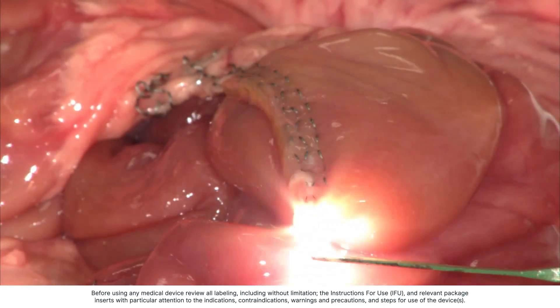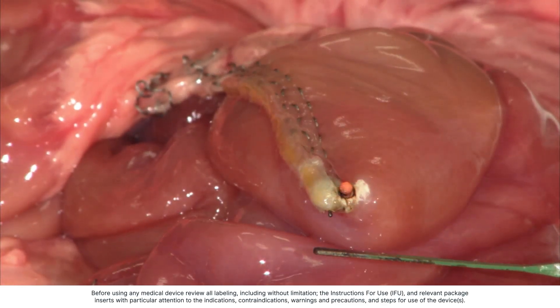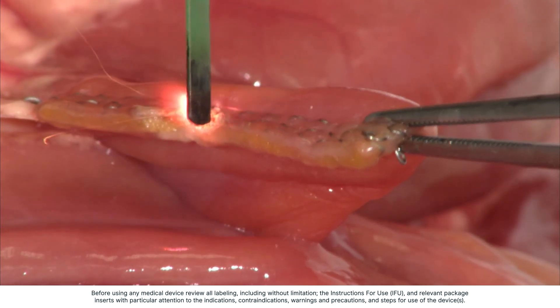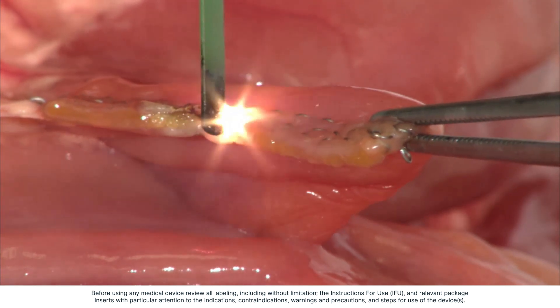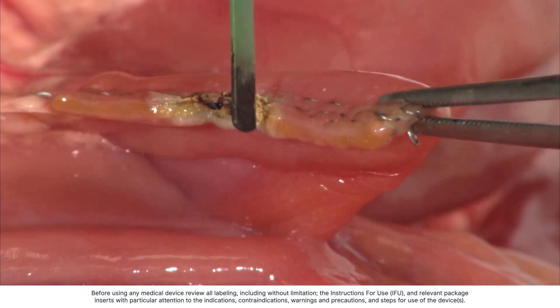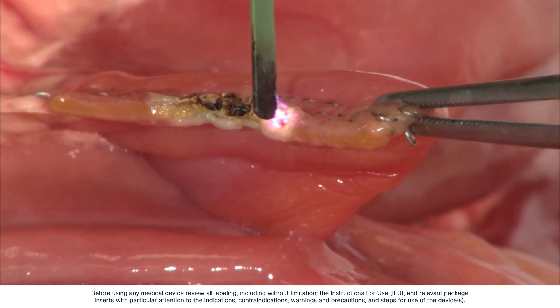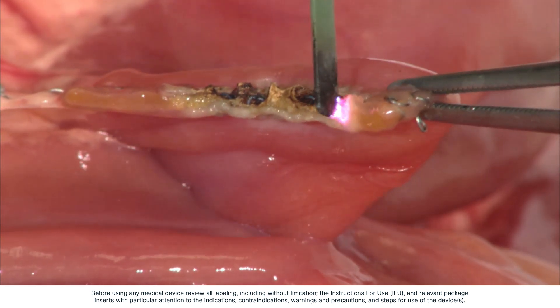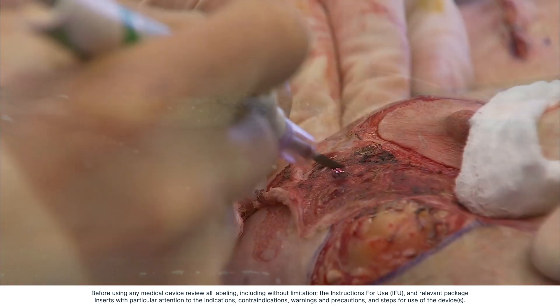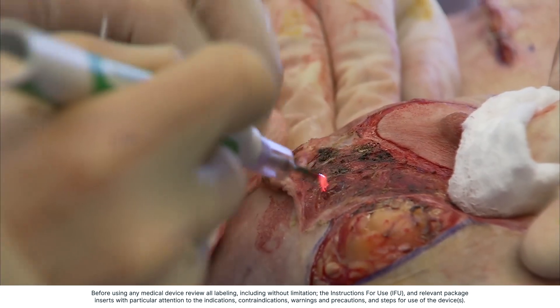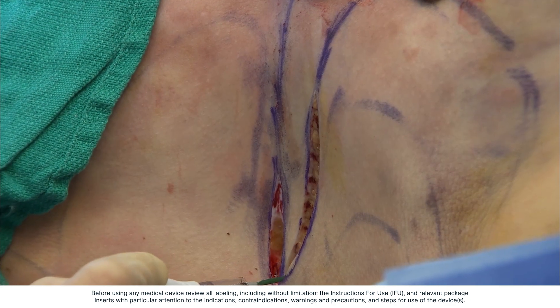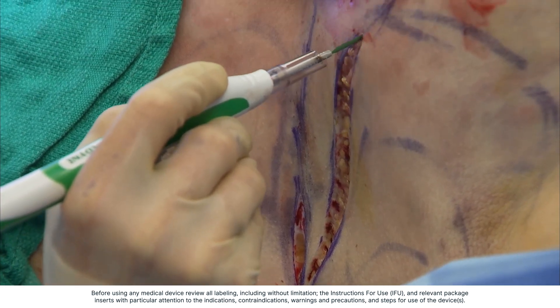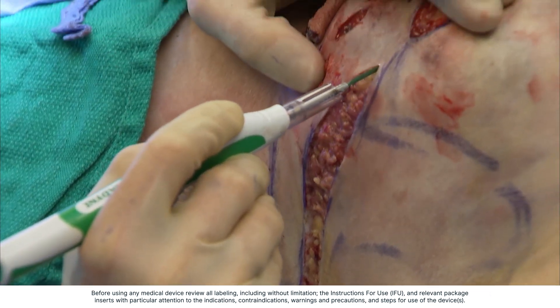Unintended direct coupling can also occur in surgery. This video shows the dangers of applying electricity near or to a staple line and the negative impact on the adjacent tissue. Not only can staples melt, but they will conduct current, producing a wide area of unintended tissue damage. When operating through a single incision, instruments in proximity can transfer energy. Unintended coupling usually happens outside the field of vision, a common issue of laparoscopy.